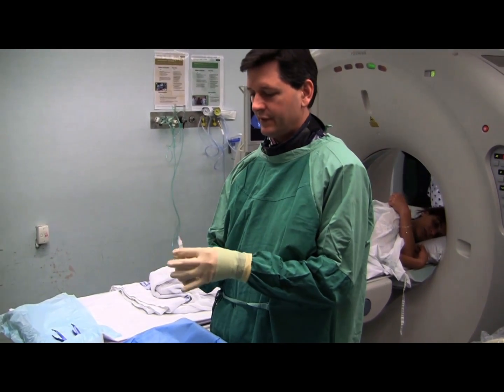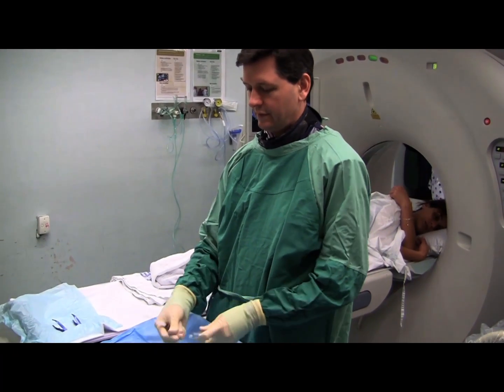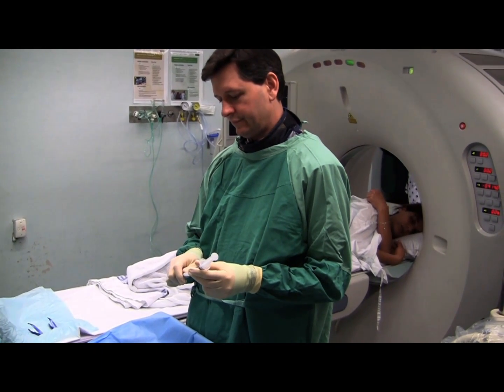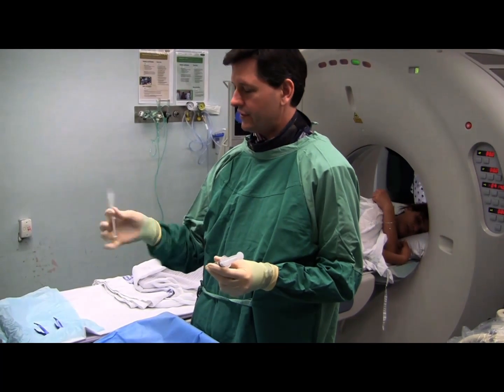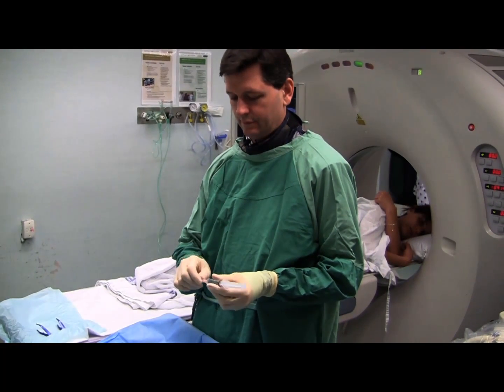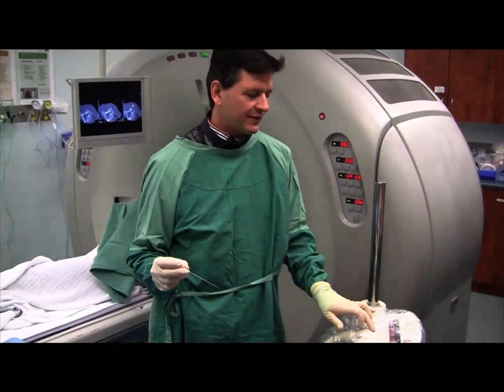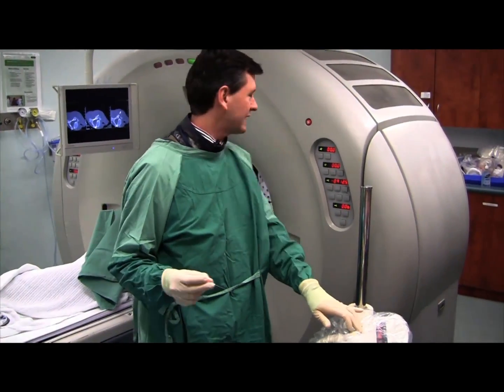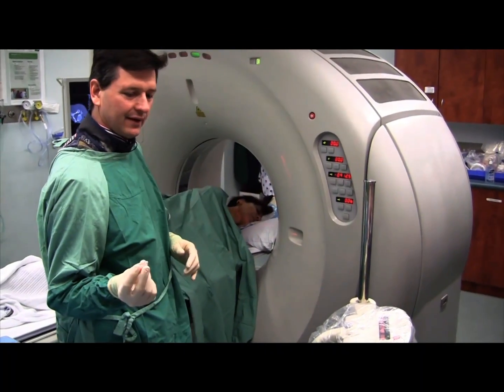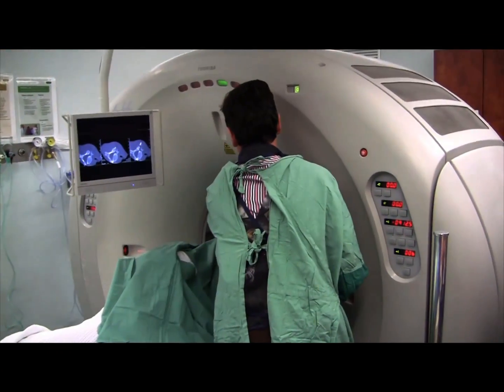Just a bit of Celestone Cronidose and Lignocaine 1% for our injection, and skin prep. We just left the 25-gauge needle in after local anaesthetic as a place marker. Switching on the laser now — we have the 25-gauge spinal and can park that in the final position.